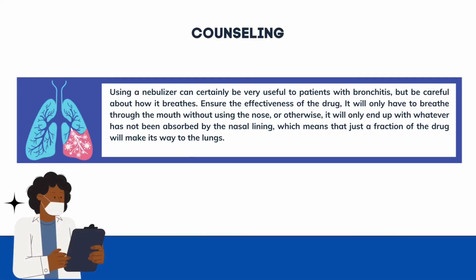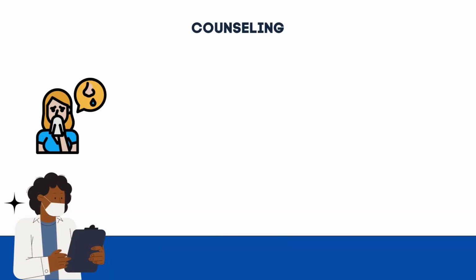Many people living with chronic lung diseases such as COPD or asthma may use a nebulizer to administer their medication. Using a nebulizer can certainly be very useful to patients with bronchitis, but be careful about how you breathe. Ensure the effectiveness of the drug. You have to breathe through the mouth without using the nose, or otherwise, you will only end up with whatever has not been absorbed by the nasal lining, which means that just a fraction of the drug will make its way to the lungs.